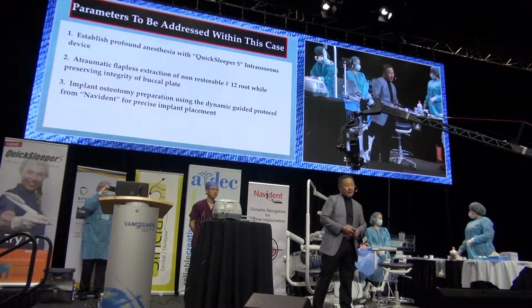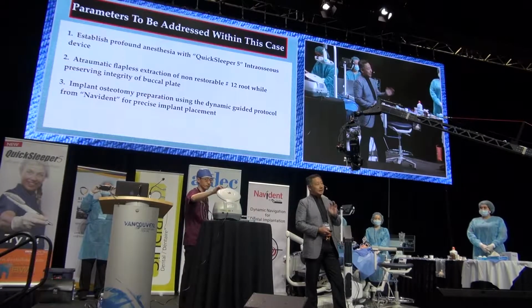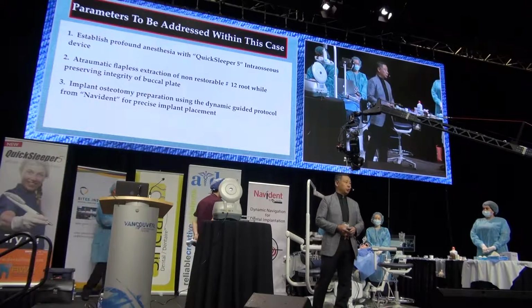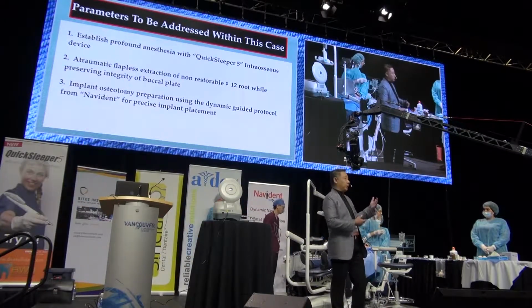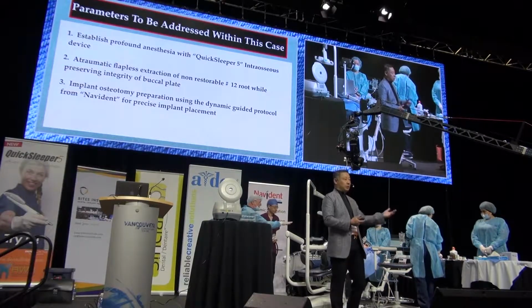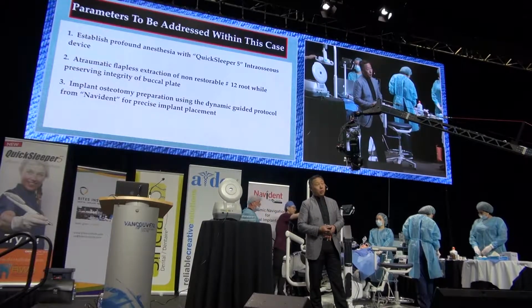Then we like to get that implant osteotomy preparation in the precise, exact position based on the planning. And any of you who are doing surgery the traditional way, you have a 2-dimensional x-ray, you do the surgery, post-op you look at it, and it wasn't quite what you thought you would aim for. Well, that kind of guessing game is not required anymore.